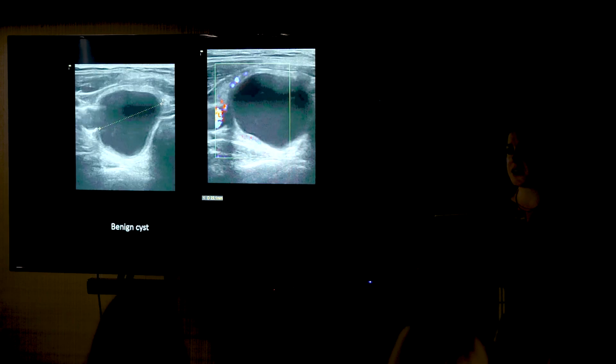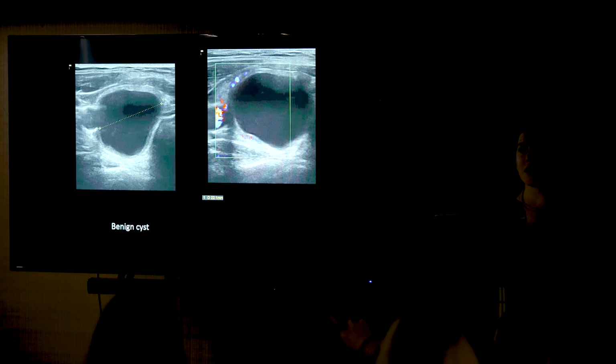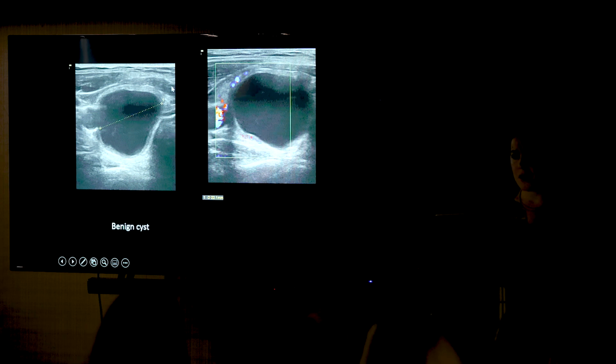So what U grade did we give this? U2, yeah, it's just a cyst. It's not a trap. What? And the walls of the cyst on the left-hand side of the picture, is that just a deformed cyst wall, or when you look at it, is it not entirely smooth? So no, this is just a simple cyst. You mean this wall down here? The one on the left-hand side. Oh, here. Yeah. I think that's a little bit of artifact. I don't think that's real, actually. Ultrasound's a bit of witchcraft. You can take a picture, and it can look a bit odd in some respects. So no, I don't think that's a real thing. I think it's just a plain, simple cyst.